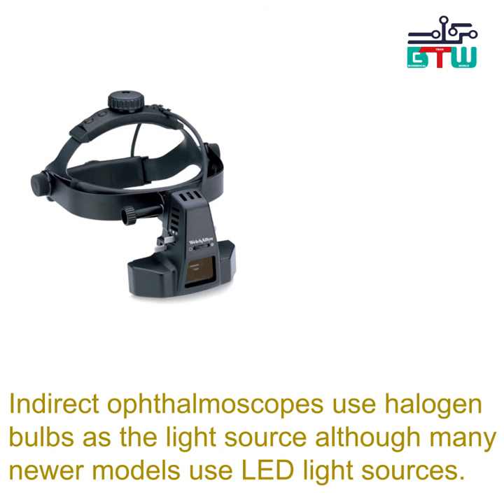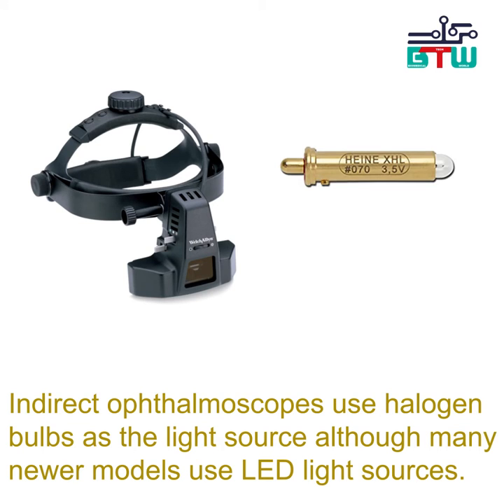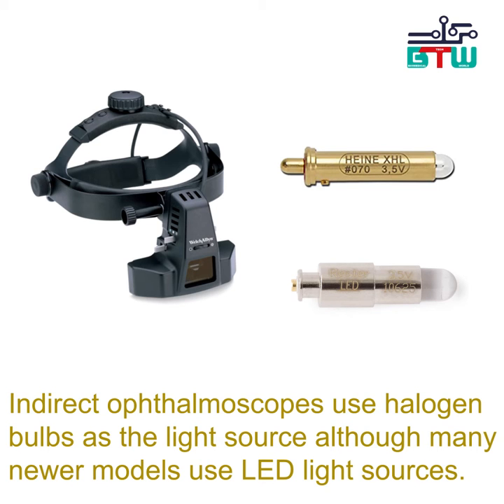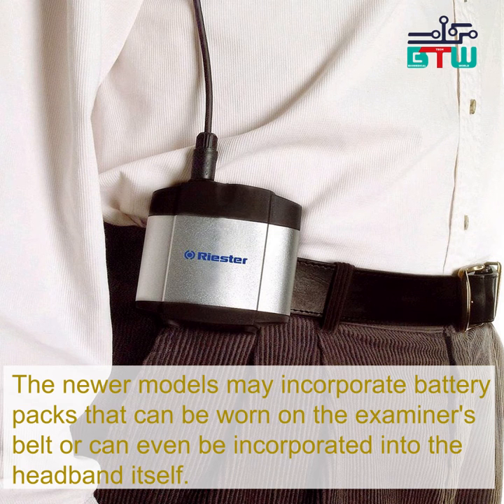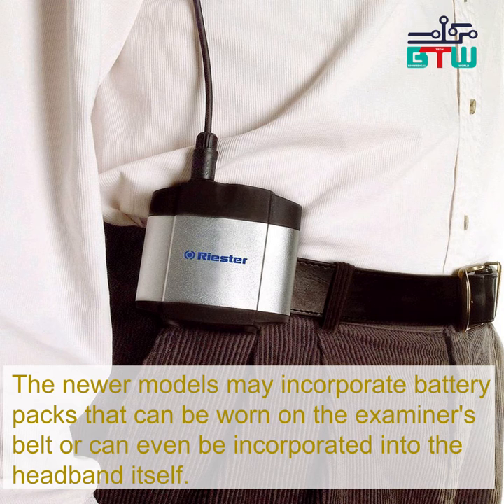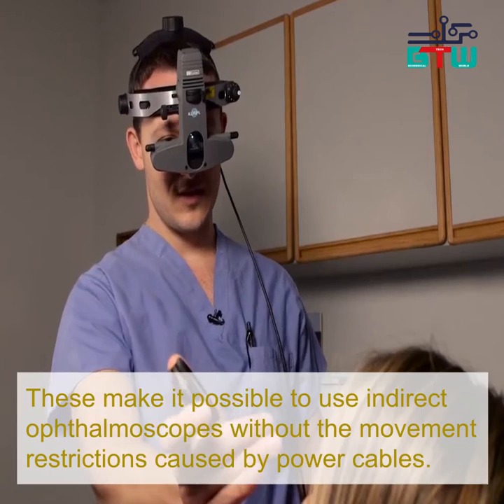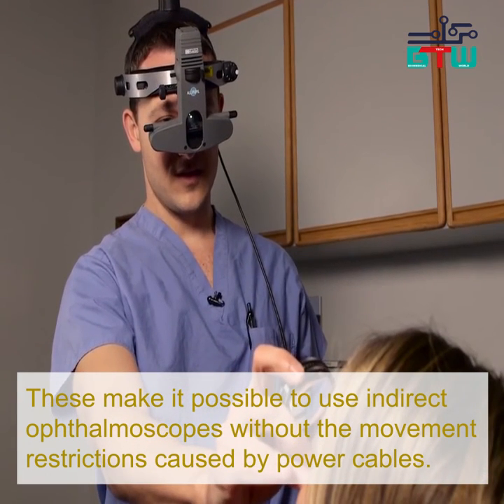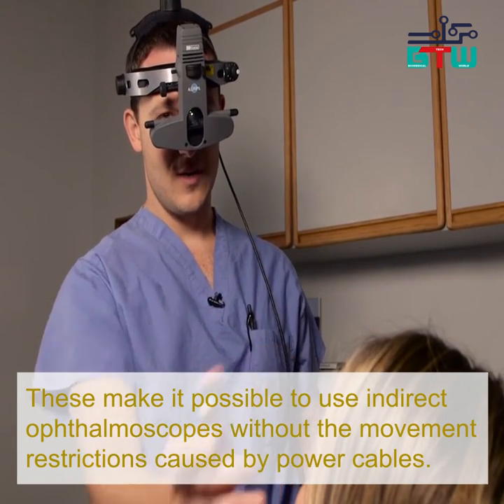Indirect ophthalmoscopes use halogen bulbs as the light source, although many newer models use LED light sources. The newer models may incorporate battery packs that can be worn on the examiner's belt, or can even be incorporated into the headband itself. These make it possible to use indirect ophthalmoscopes without the movement restrictions caused by power cables.